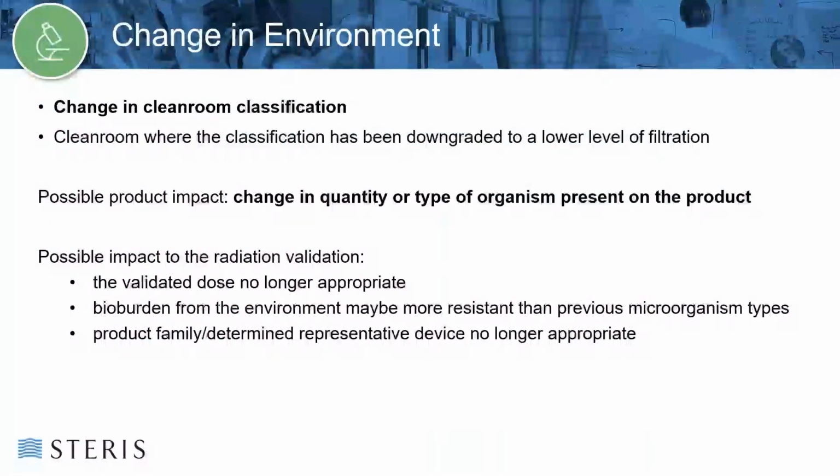Another change in the environment might be a change in cleanroom classification. For instance, a situation where classification has been downgraded to a lower level of filtration. This change would also have a potential to change the quantity or type of microorganisms present on the product, which in turn could affect the validated dose by it no longer being appropriate.